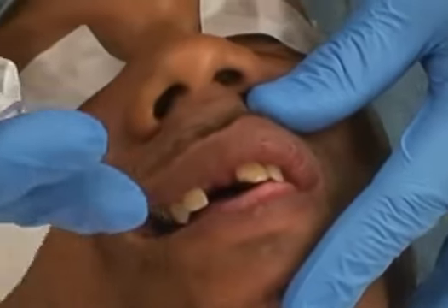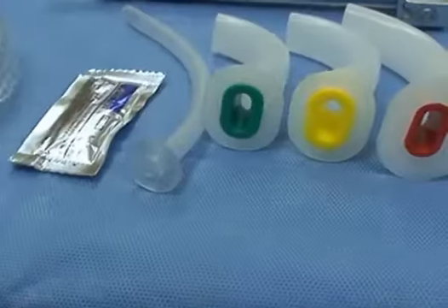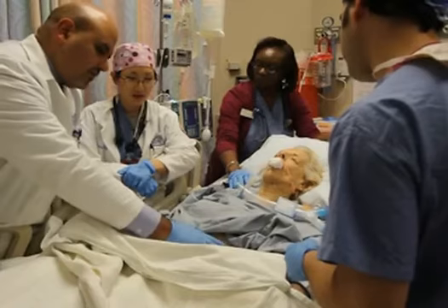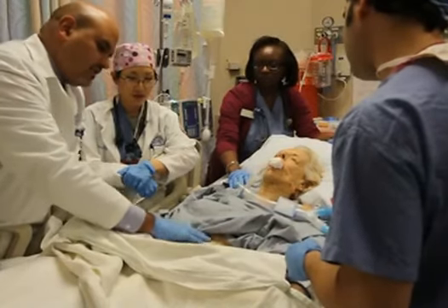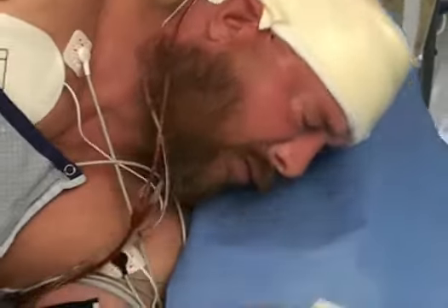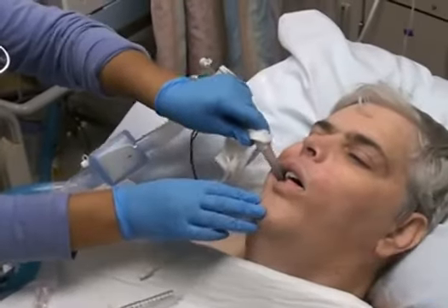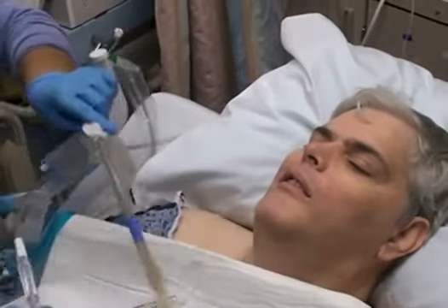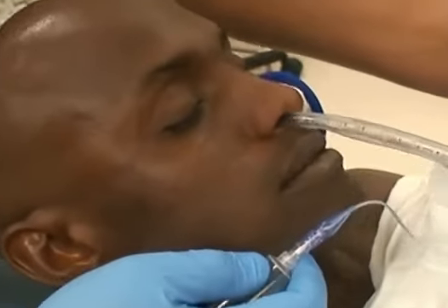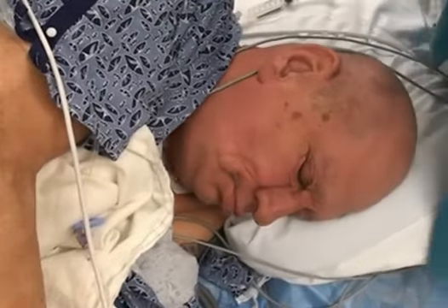Endotracheal extubation should be performed without causing trauma, while maintaining adequate oxygenation and ventilation. Appropriate equipment for suction, ventilation, and reintubation should be available. If extubation is judged to be unsafe, the procedure should be postponed and the patient should be reevaluated. Most complications related to extubation are preventable. Before performing extubation, the clinician must carefully prepare the medical resources needed to address foreseeable complications. A failed extubation can lead to a precipitous deterioration in the patient's condition, and attempts to improvise solutions under these challenging circumstances are rarely satisfactory.